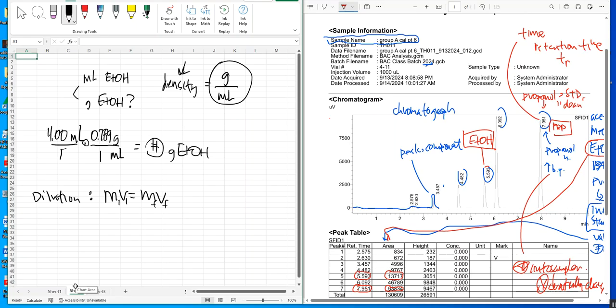The first M, well, that stands for molarity, but we don't have molarity. We have percentage. Can it still work? Absolutely, it can still work, because really the dilution equation is CV equals CV, where these are 1's and 2's or I's and F's. That means any concentration will work, no matter what it is. Any concentration will work. I don't care what it is. Trust me, done it long enough.